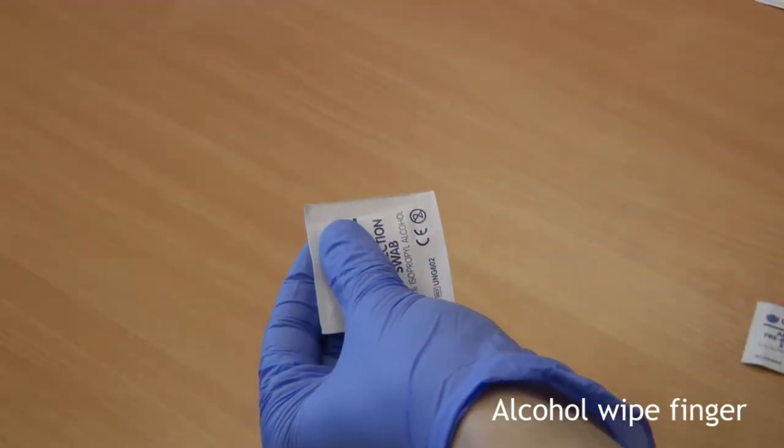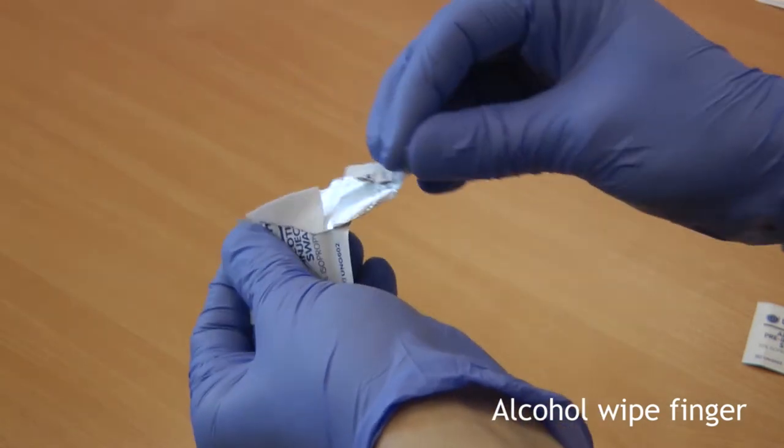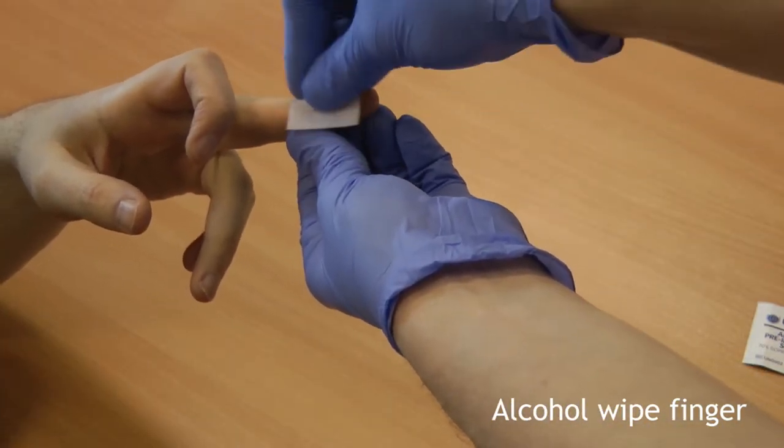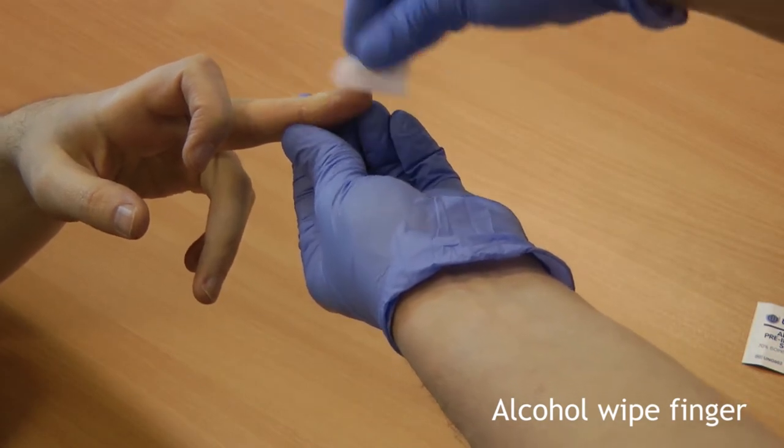Next, take the alcohol sachet. Clean one of the middle, ring or little fingers. Please avoid the finger pad and nail bed.